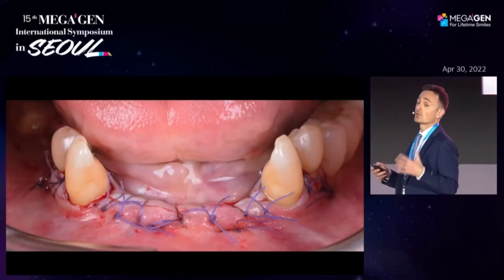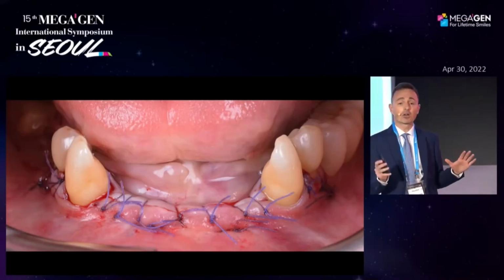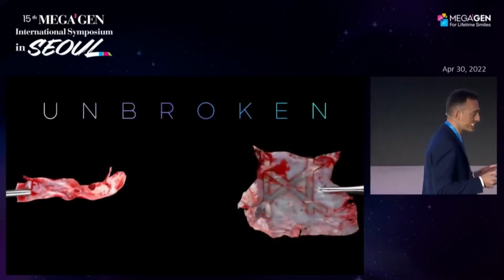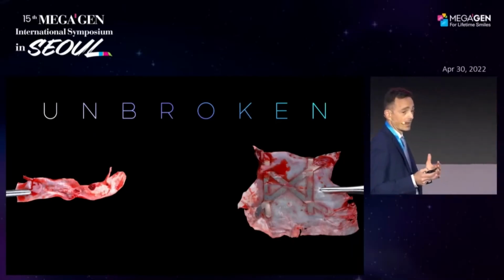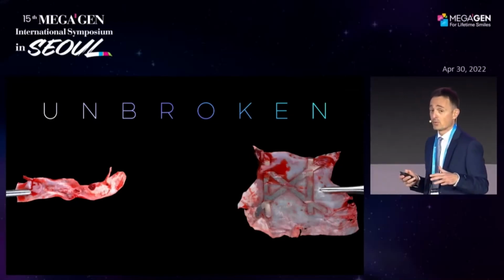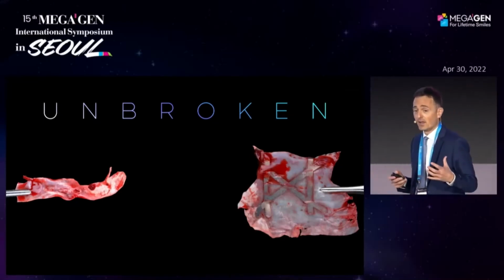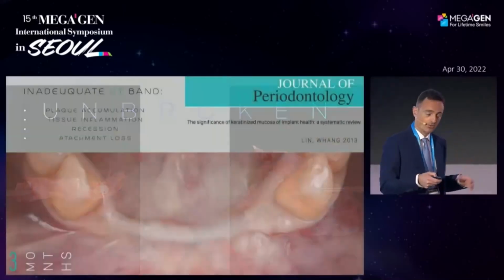And obviously we need to close everything, once again, by primary intention, respecting the biological timing. I also suggest you be sure to remove everything and not leave the PTFE in the wound, because you are managing something contaminated, and you need to be sure not to have infection after the surgery.